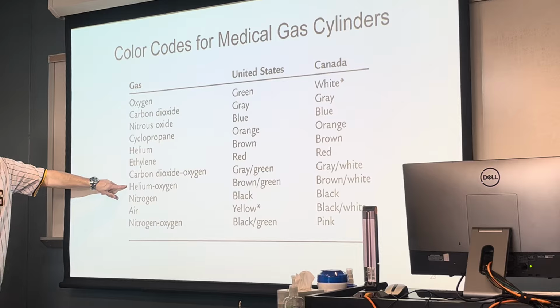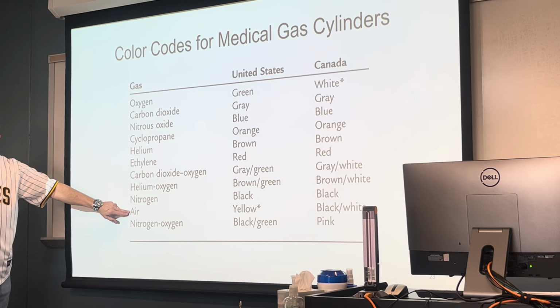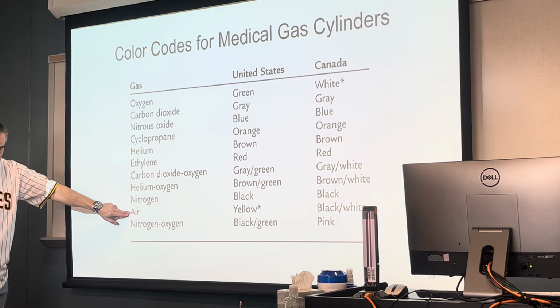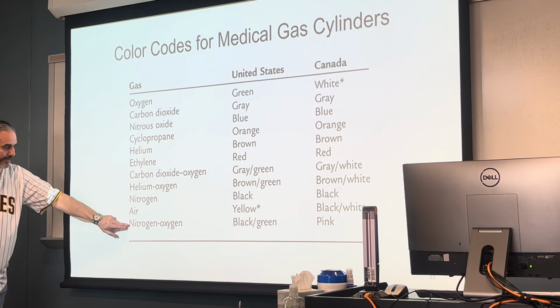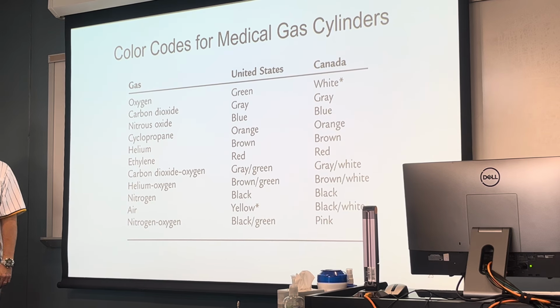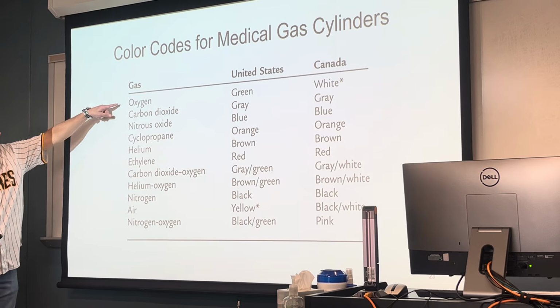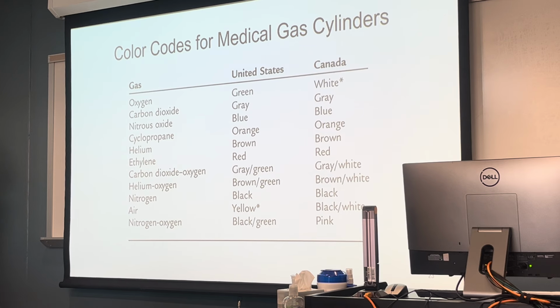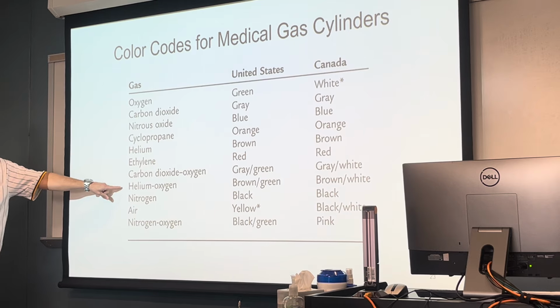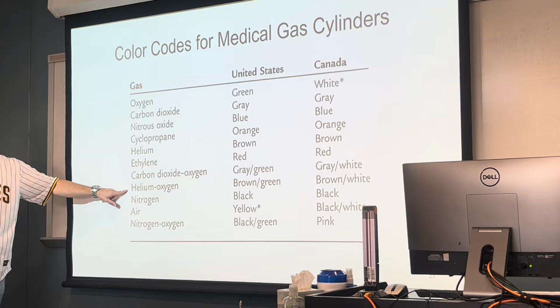So I will ask about helium. I'm not going to ask about nitrogen. I will ask about air. Since I'm not asking about nitrogen, I'm not going to ask about the nitrogen-oxygen mixture. But what are the two most often that you're going to encounter in a hospital setting? Oxygen and air. If I had to pick a third one as far as popularity, heliox would probably be the next one on the list as far as what you're going to see most frequently.